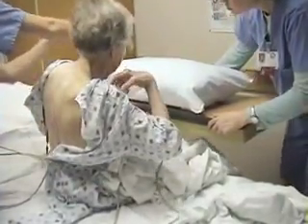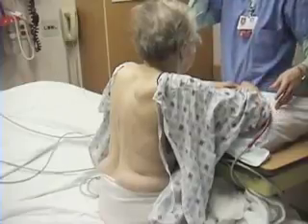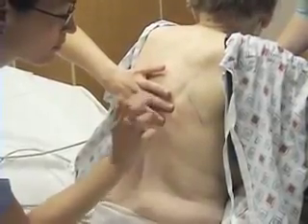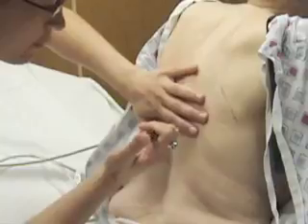You will need an assistant to help position and monitor the patient and assist with the collection of pleural fluid. Place the patient in a sitting position on the edge of the bed with his or her arms resting on a table. The height of the effusion is determined by auscultation and percussion of the posterior chest wall. With a skin marking pen, mark the needle insertion site.